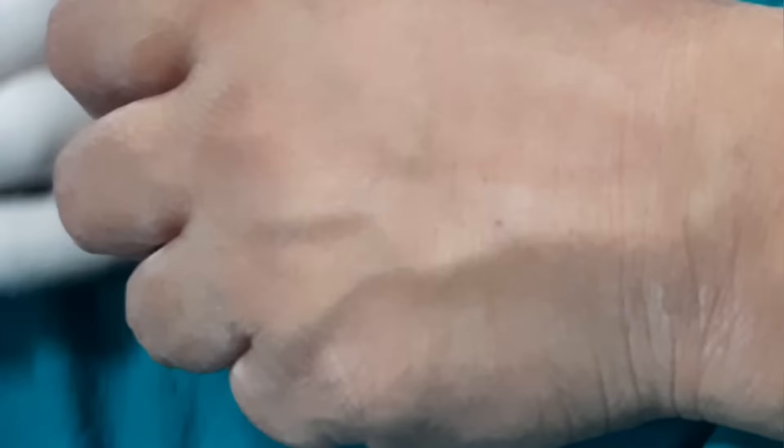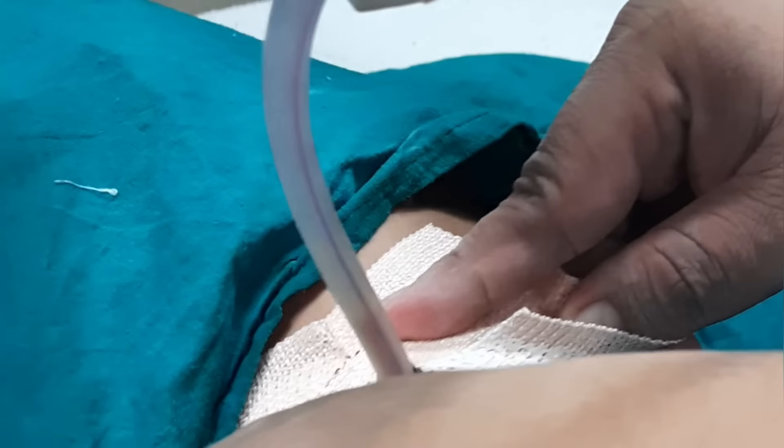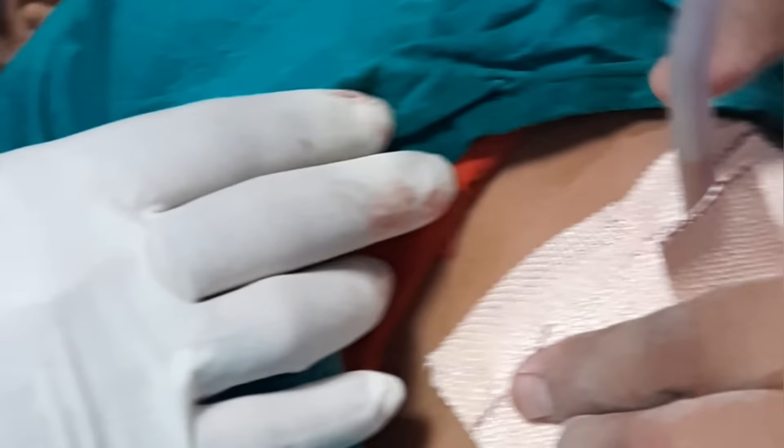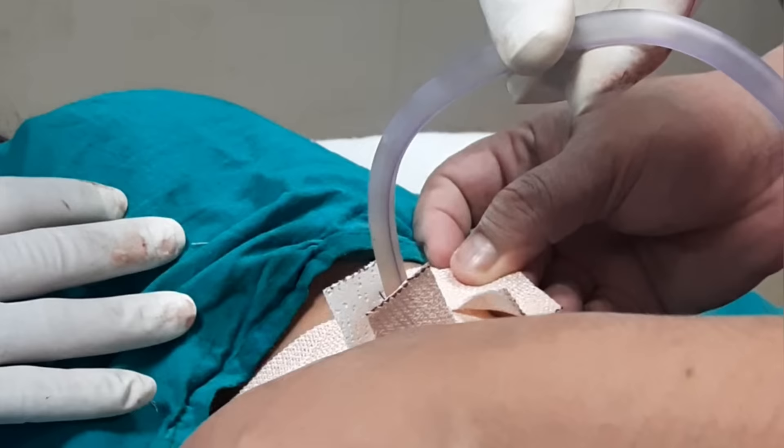Now we cover the site with band-aids. There is no need to use large band-aids; small band-aids work better. We paste small band-aids over the site. We take another band-aid, cut on two ends, and use it to stick the chest tube in place. We repeat the same band-aid on the opposite side to secure the chest tube.